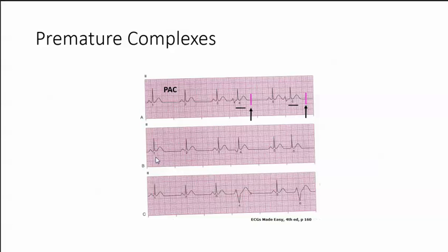The second strip: all these are normal. But we've got an inverted P and no P. The beat should have happened here, and then the next beat after number five should have happened here. We have a premature beat that has an inverted P, and the other one has no P. That's a PJC, or premature junctional complex.